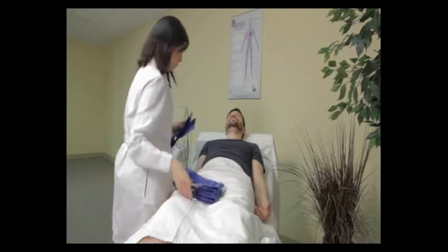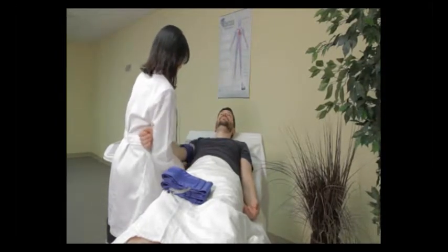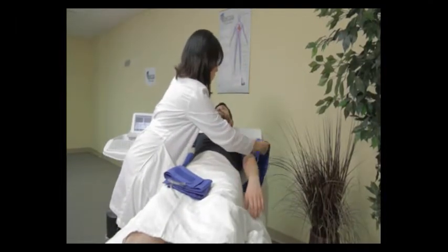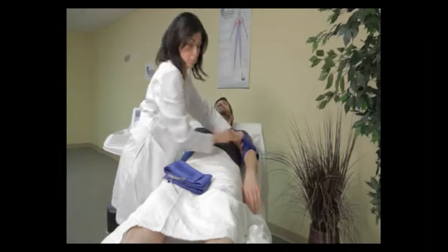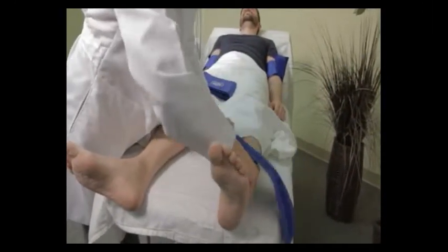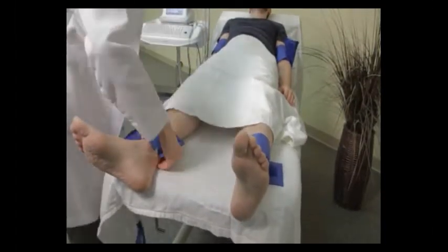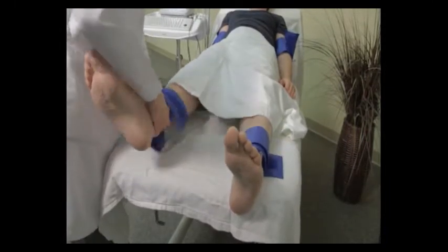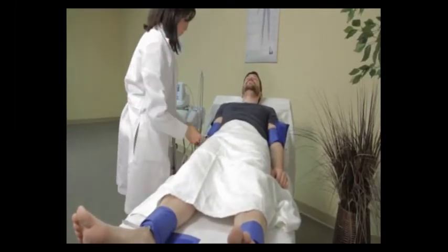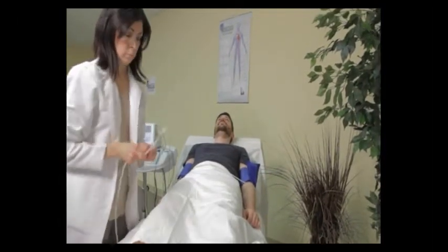She's going to start by putting the cuffs on the arms and the ankles. Now she's attaching the hoses to the cuffs. The REVO 1100 has four separate pneumo hoses — one for each arm cuff and one for each ankle cuff — so you do not need to move hoses in the middle of an examination.